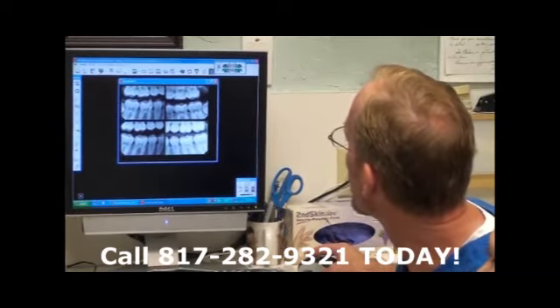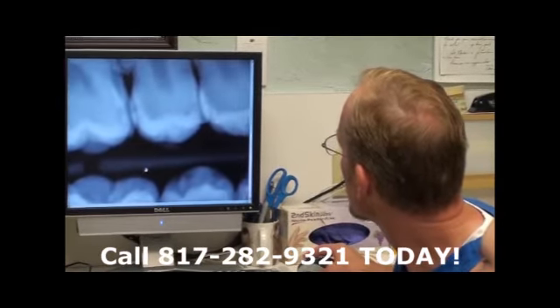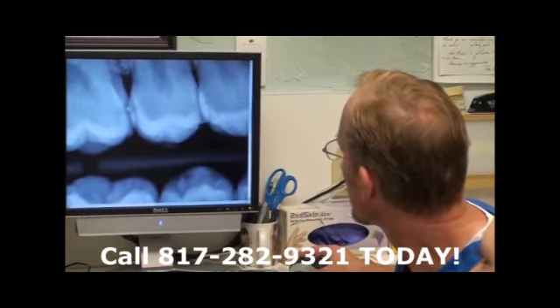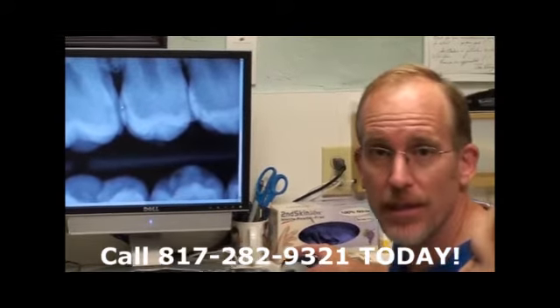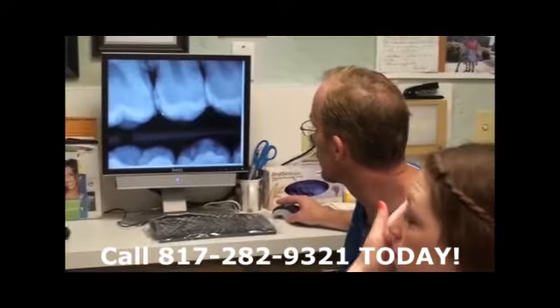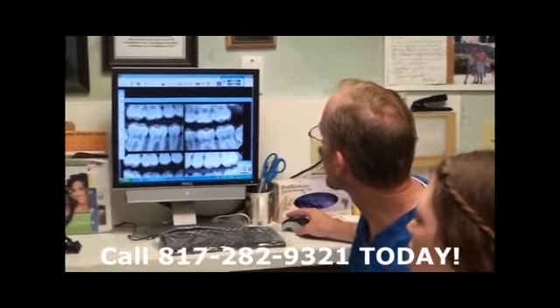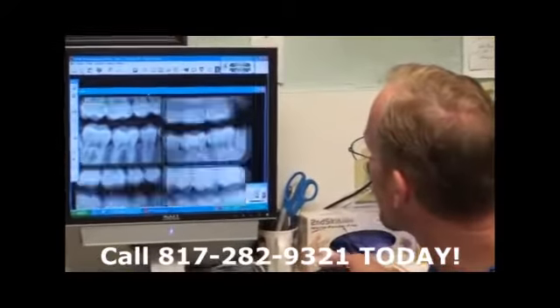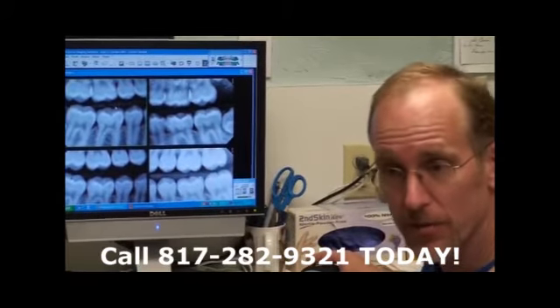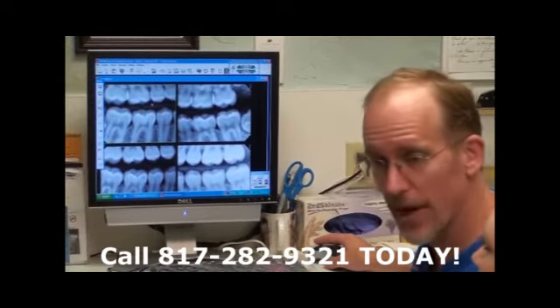For example, on this x-ray here, I can see a little shadowing in between the teeth, and that is what they call an incipient lesion, or it could be a cavity depending on how far it goes into the tooth. When I look at her images, looking from further away is actually better, because you can see the image from a distance. You can see more contrast rather than having it so large.